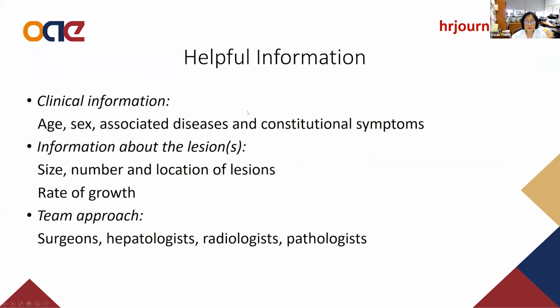So helpful information: of course, we try to look at the biopsy specimen without any information, but this kind of information is very helpful in making the final diagnosis. For example, the clinical information. In any biopsy, I would start with the age of the patient, the gender, the associated diseases and constitutional symptoms, and also the information about the lesion itself that was seen on imaging: the size of the lesion, the number of lesions, and the location.